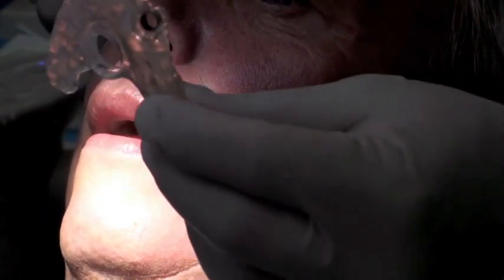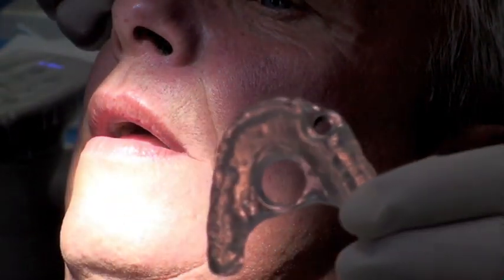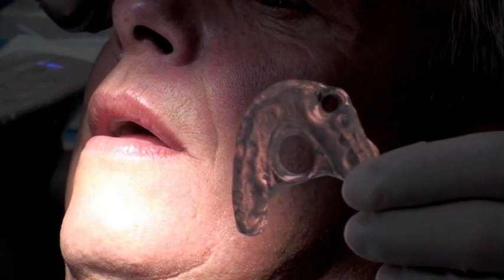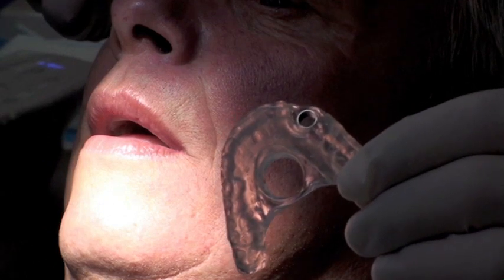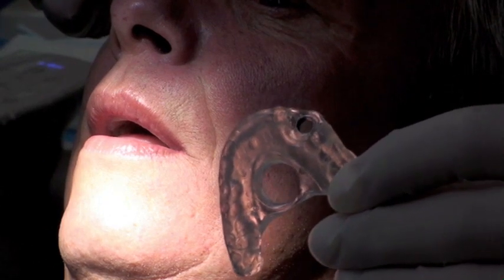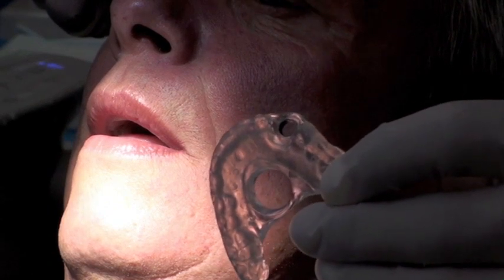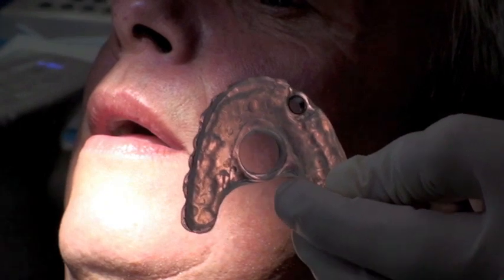This is our patient Larry, and this is appointment number 2. The Cerec integration allows us to actually go from appointment 1 directly into the surgery on appointment 2. This plan was exported into the implant program, and we were actually able to generate this surgical guide without any impressions, without any models.